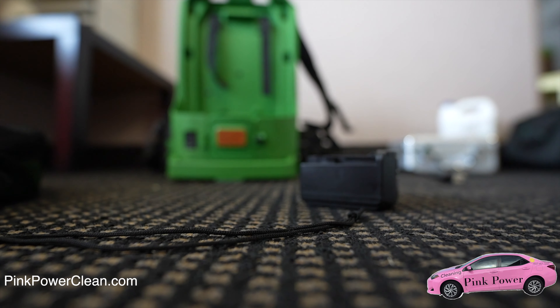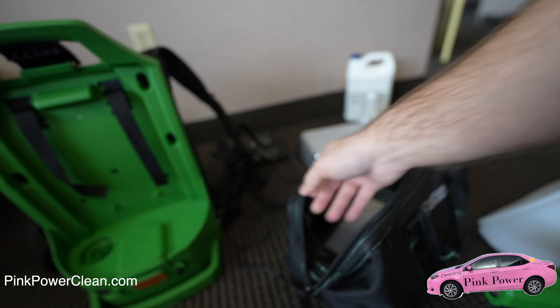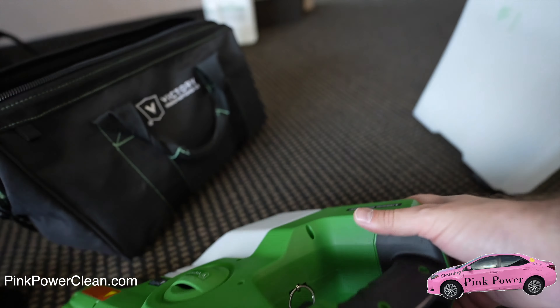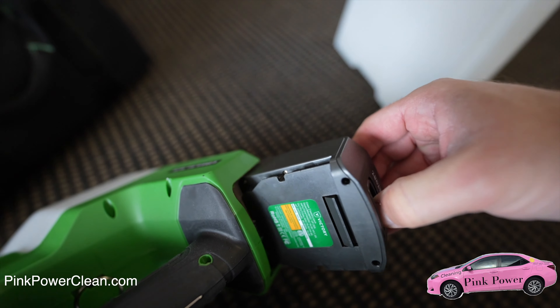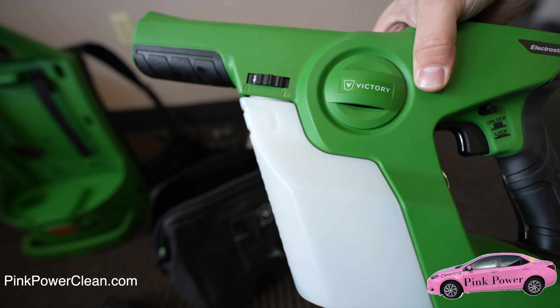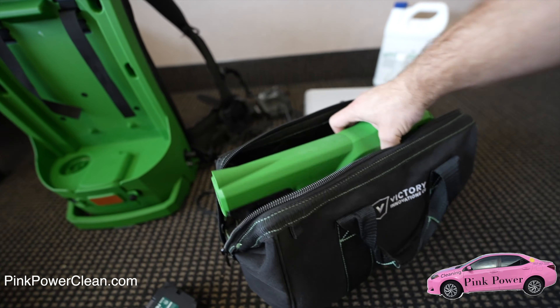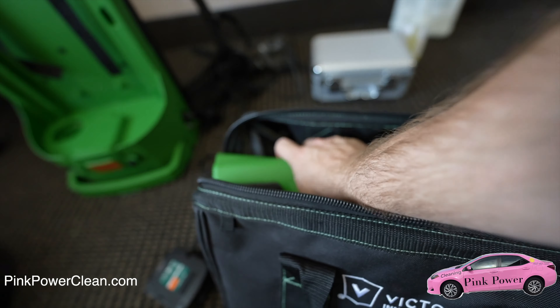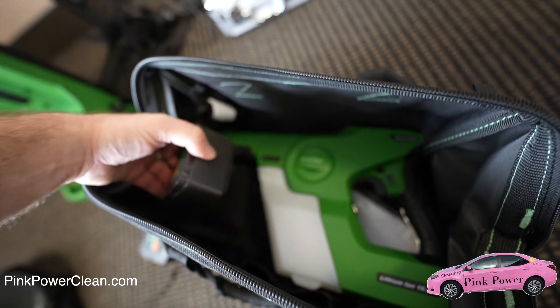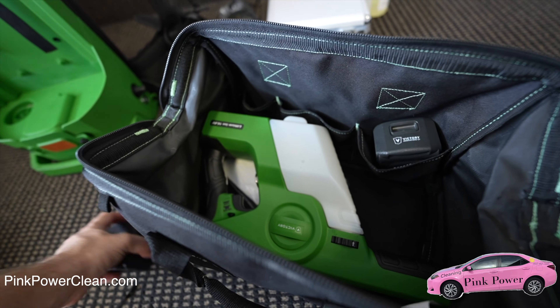Now we're going to put the batteries in the bag with the portable little machine. I'm going to pull the battery out of this one too — you just push down and then slide back. We want to make sure that the tank is empty, and it looks like it is. So we can put it into the bag. I typically put it on the bottom so I can fit more things in, and then we put the batteries on the side.